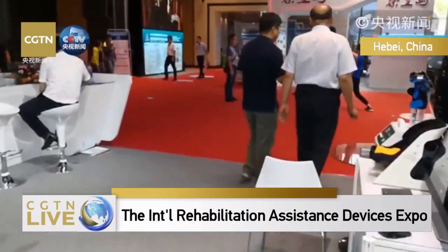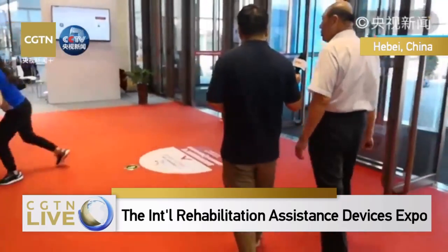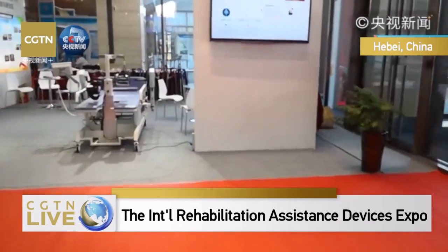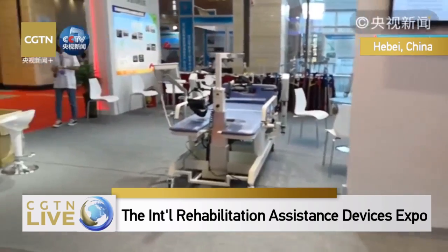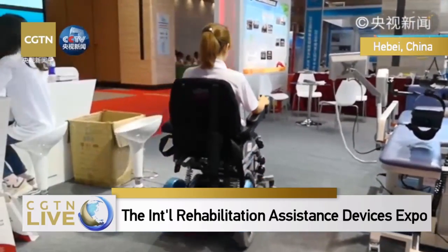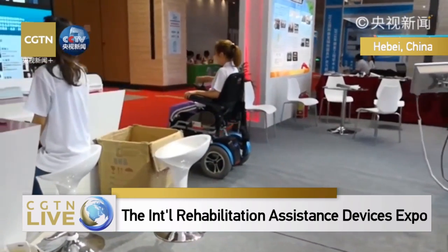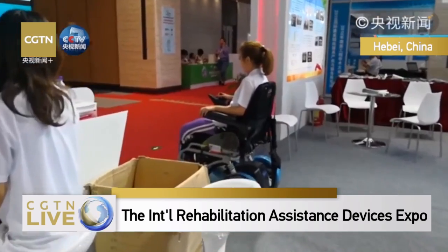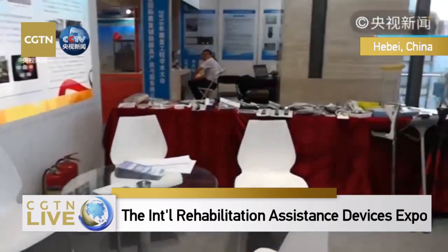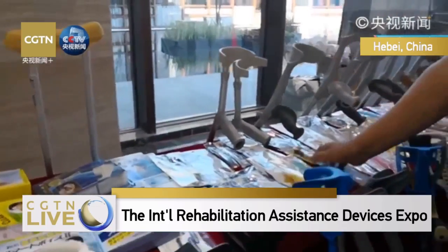So why did the Expo choose Qinhuangdao as the location? The city of Qinhuangdao is identified as one of the 12 cities that has pilot projects for rehabilitation robots. Together with this is the capital city of Hebei province, Shijiazhuang. Because Qinhuangdao is a city with very favorable natural conditions and climate, and it's a very good place for rehabilitation and old age care.